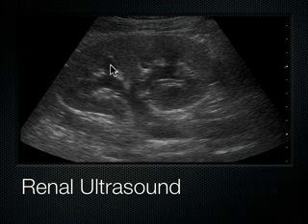And so then these pyramids, they all coalesce and drain into the renal pelvis, or sometimes you call this the sinus of the kidney. And here, this is why it's anechoic, because there's more fluid coming there, and then eventually they exit out the kidney and into the ureters. And the ureter comes down, one from each kidney. They come down and they enter into the bladder, in the back of the bladder. And you don't see the ureters very well on ultrasound because the ureters are covered by bowel and fat and things like that. So they're really hard to see. They're very small usually. Unless they're dilated, then you can see them. So once the ureter kind of exits the kidney, we no longer see it.